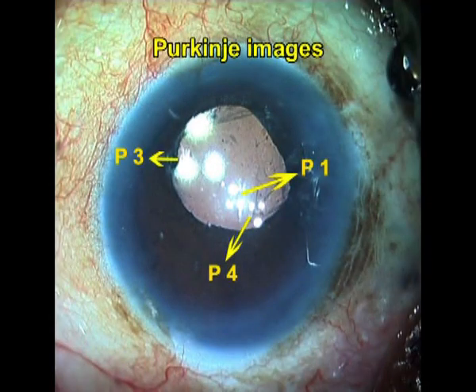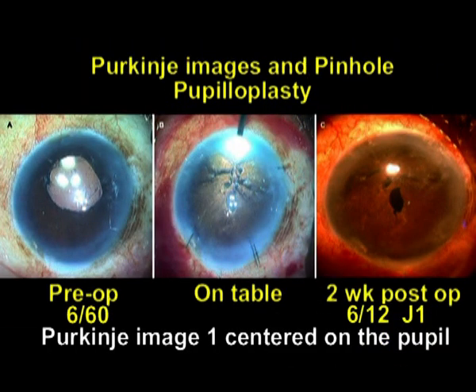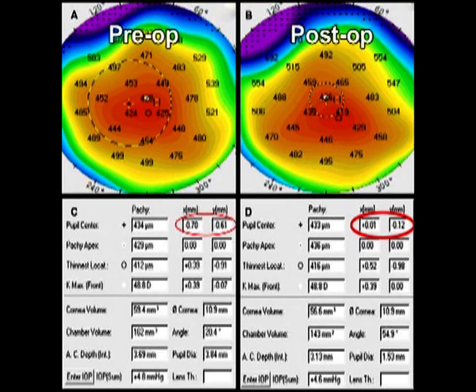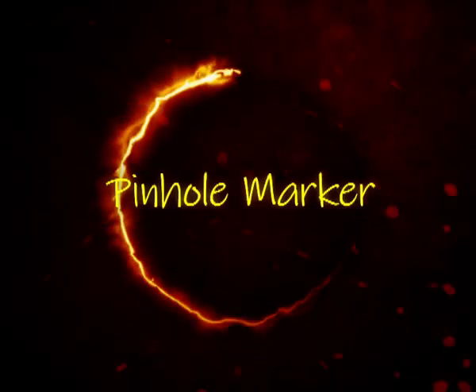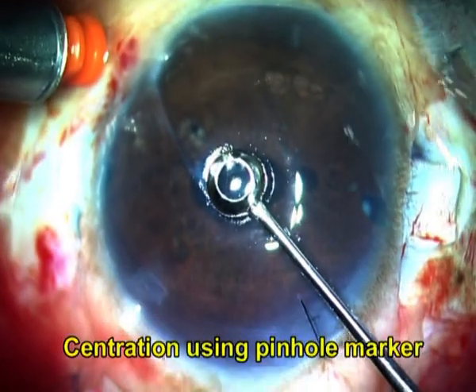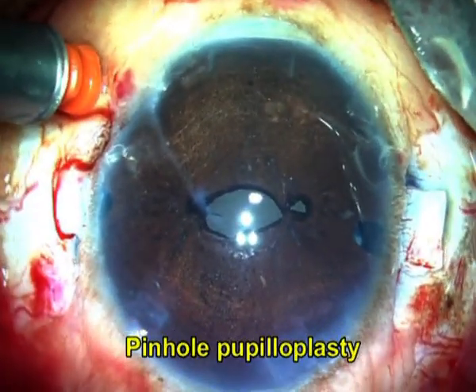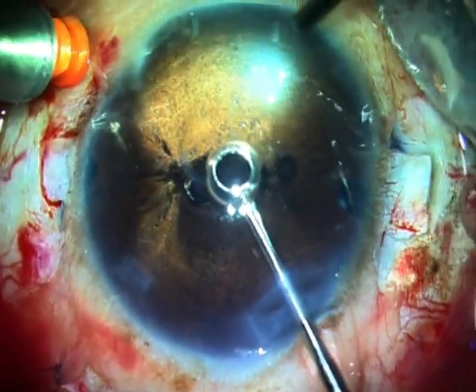Centration of the pupil can be achieved preoperatively by marking the center of the cornea or intraoperatively by gauging the position of the light reflex of the microscope. Pinhole allows light rays to reach the retina without the interference of optical problems of the eye. Intraoperatively, a measuring caliper or intraoperative OCT can be used to quantify the pupil size during surgery. We designed a pinhole marker with a diameter of 1.5 mm. This can be passed into the anterior chamber to help create a 1.5 mm pinhole pupil.